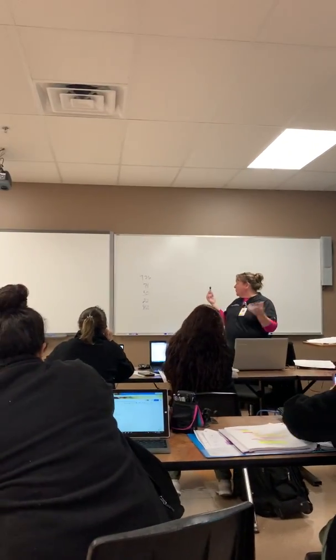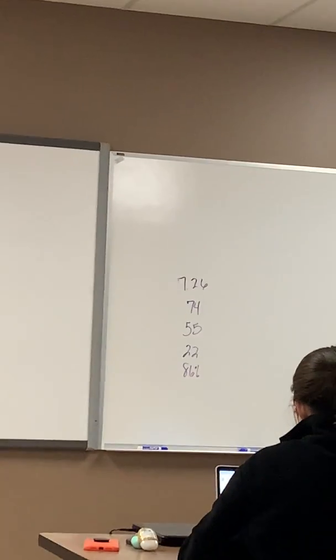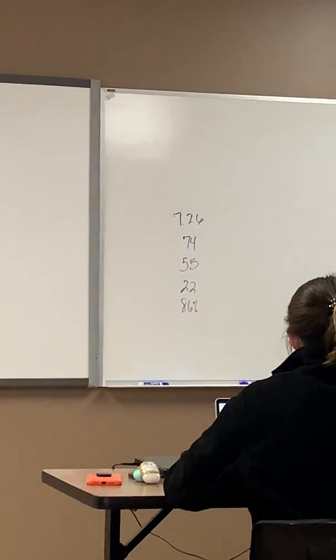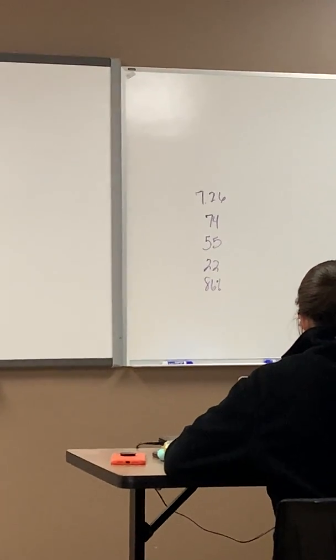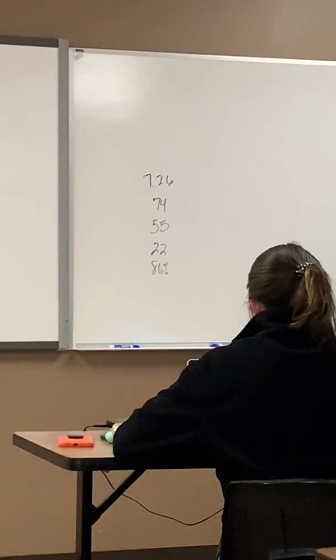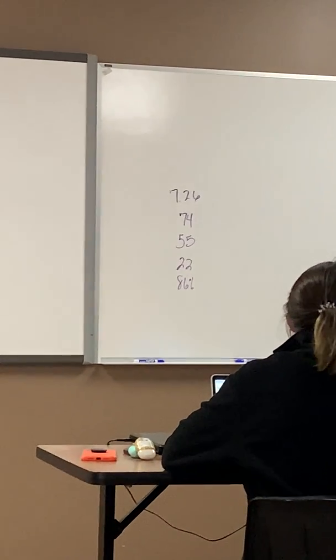Volume, rate, FiO2, repeat. So think about it. Robbie, what do you want to change here?